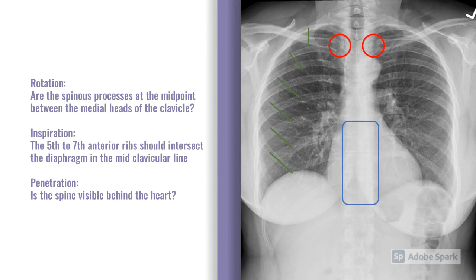The red circles indicate where the clavicle heads are. We want to make sure that the spinous processes are in the middle of the two clavicle heads. Inspiration-wise, the green lines indicate the ribs. Ideally, you want the 5th, 6th, or 7th anterior rib to intersect the diaphragm in the mid-clavicular line — demonstrated here with rib 6 going through the diaphragm. With penetration, we want to make sure that the spine is visible behind the heart. In practice you can easily manipulate the exposure by right-clicking and dragging around the image.